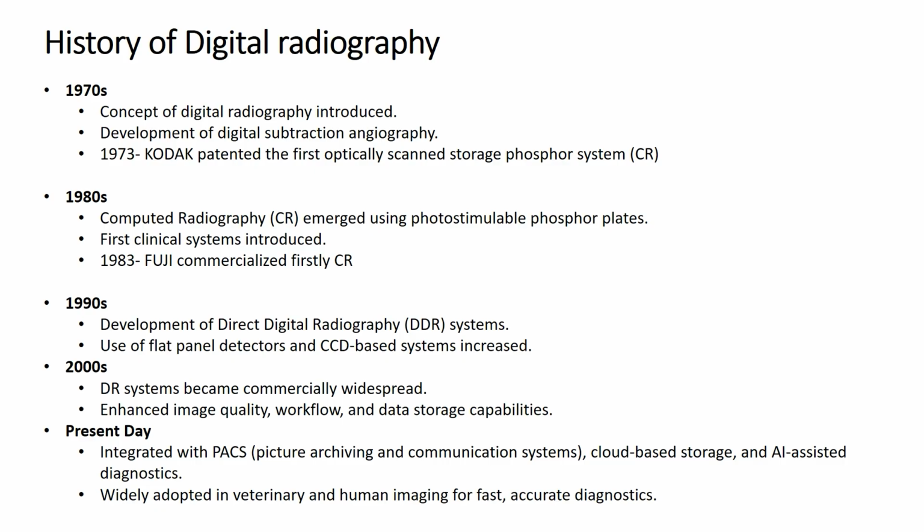Then in the 1980s, the first clinical use of computed radiography was introduced by the company Fujifilm in 1983. Afterward, many developments were going on.